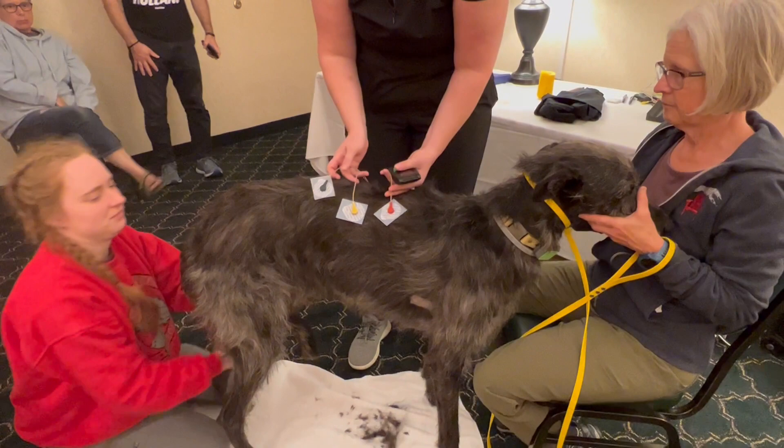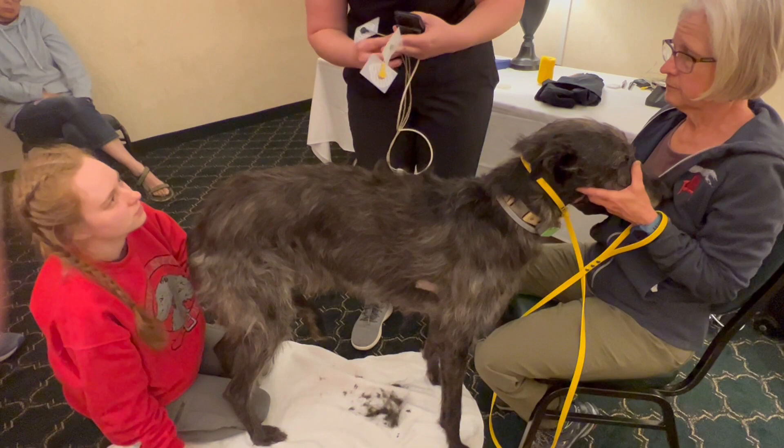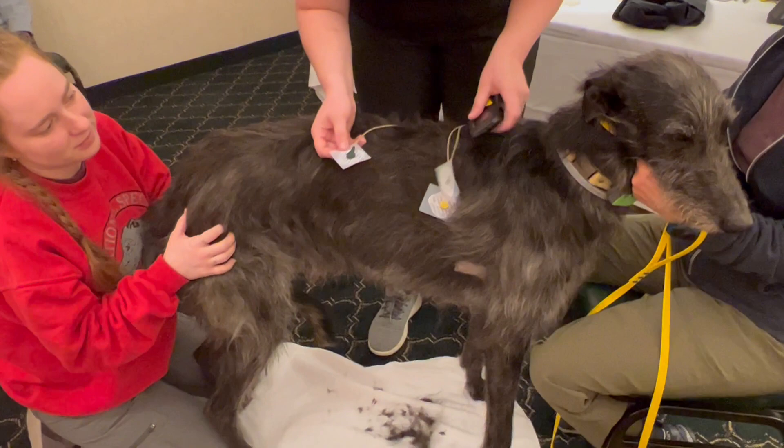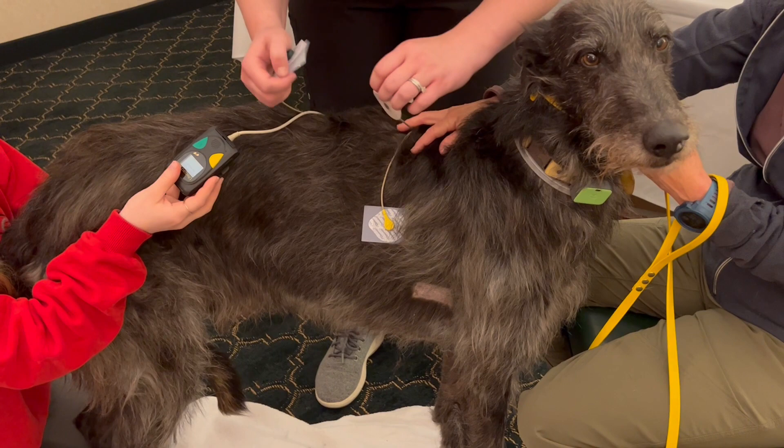Now we have our leads already connected to our electrodes, which makes this part a little bit easier. The red electrode goes on the right side of the dog. The red lead goes on the right side of the dog — I just peeled it off of the sticky.